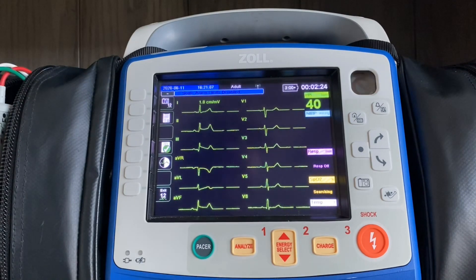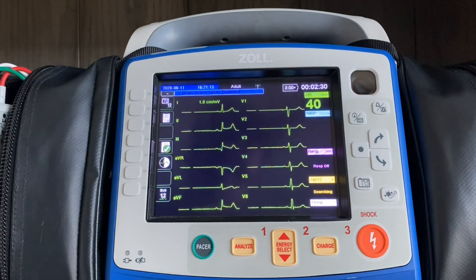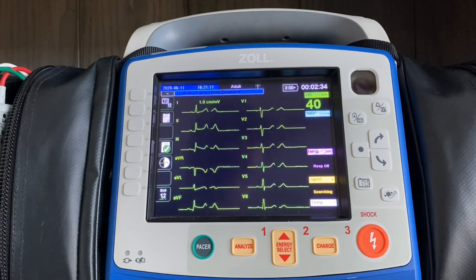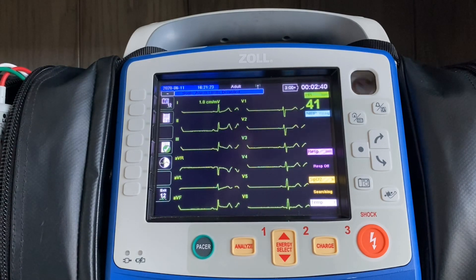The value of that is now I can look at this and say all my 12 leads look good. Before I go to acquire this on the patient, I have a visual to confirm that everything is a clean tracing, there's no issues with electrodes, and that the patient isn't moving around aggressively.